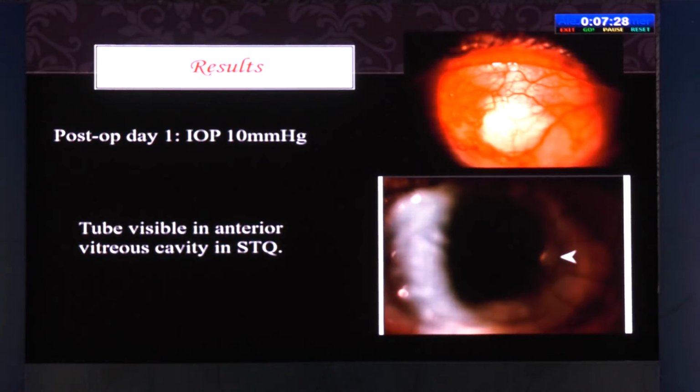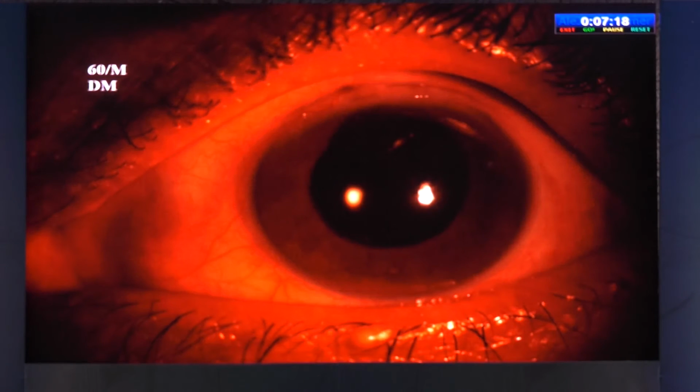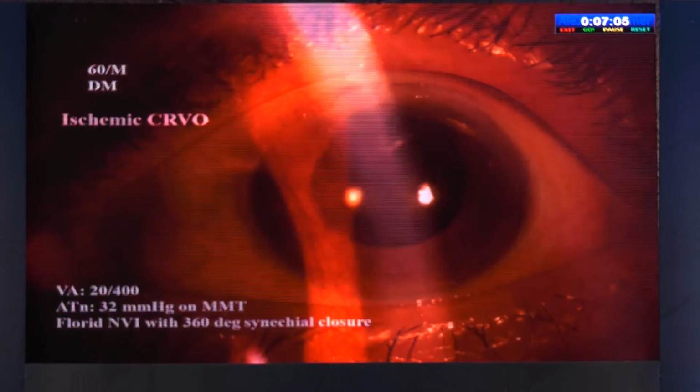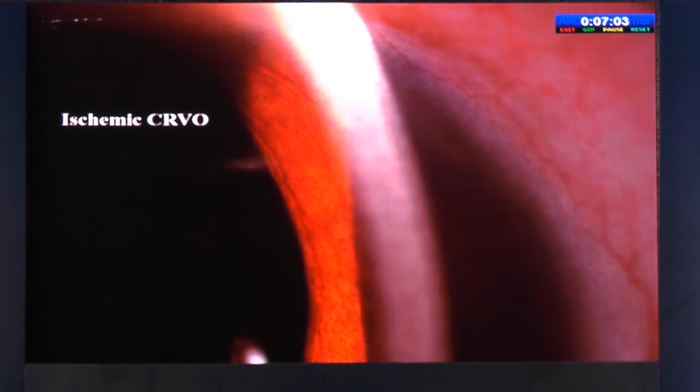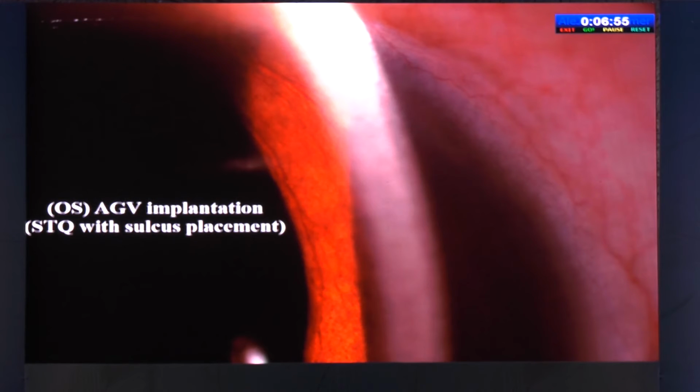The one day post-op pressure was 10, and the tube was visible in the anterior vitreous cavity. It was maintained at 4 months as well. This is another case of a 60-year-old male who was a diabetic, vision was 2/400, high pressures on maximum therapy, and there was florid neovascularization of the iris with 360 degrees synechial closure. Fundus evaluation showed an ischemic CRVO, PRP was done, still the pressure did not come down. So we planned an AGV with the tube in the sulcus.